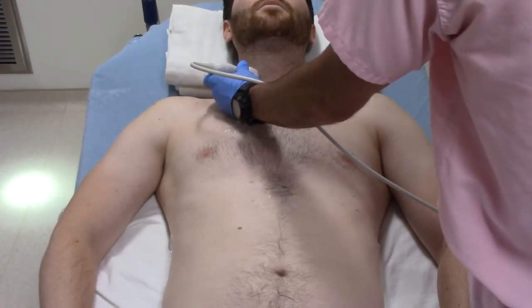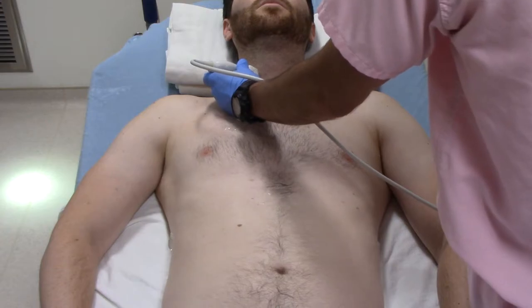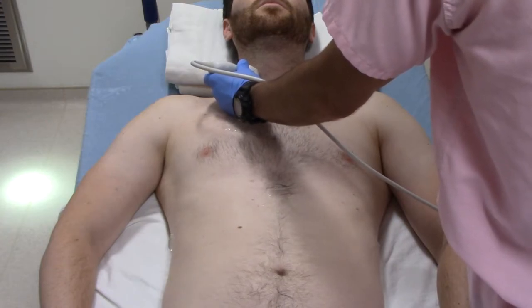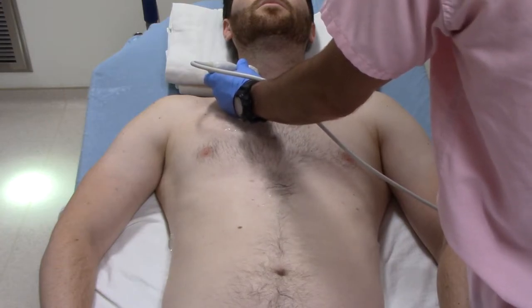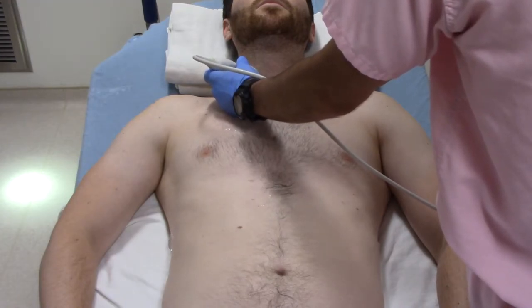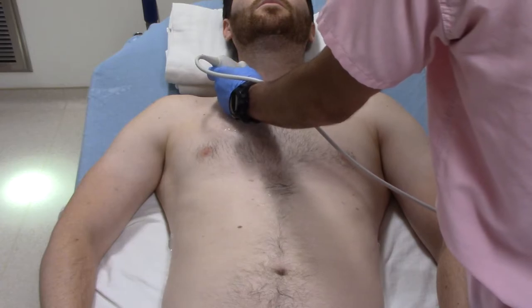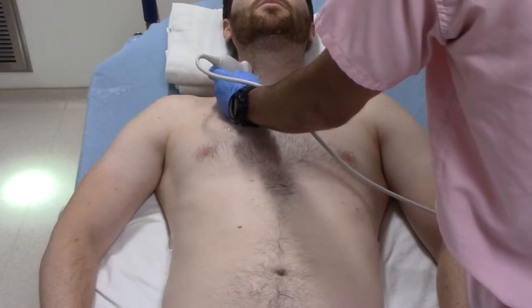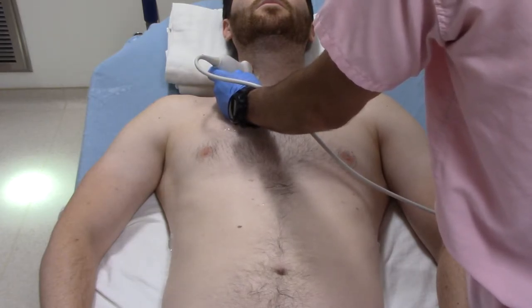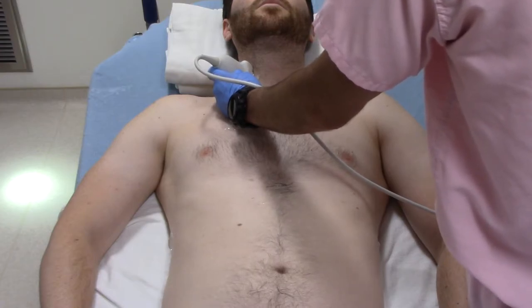Find your image and acquire — it gives us a few seconds of imaging. From there we do want to get longitudinal imaging, which is a little bit more difficult. Rotate the transducer 90 degrees clockwise towards the patient's head. Rest your hand on the patient, indicator towards the patient's head, and acquire that image.